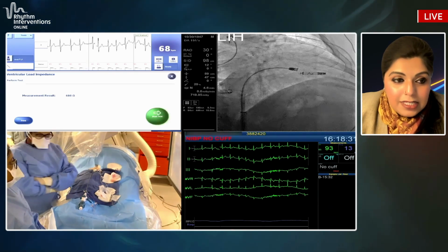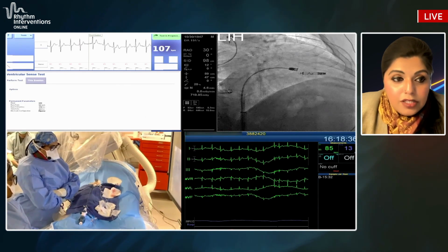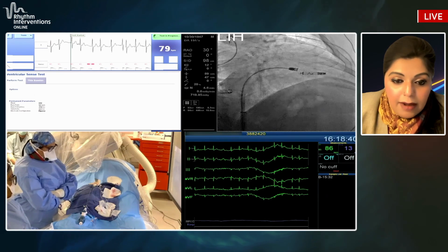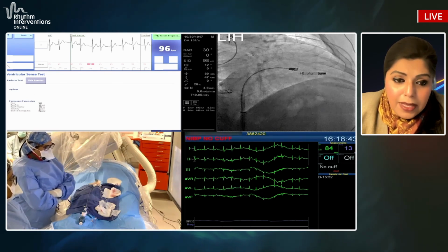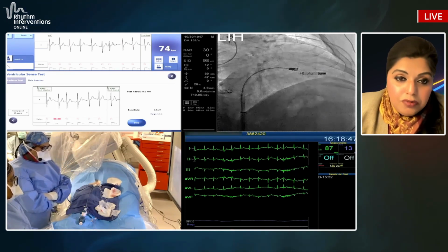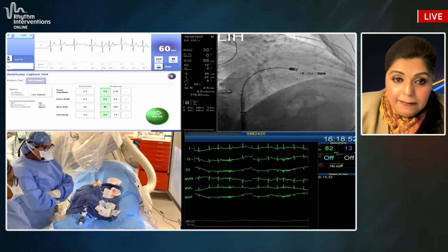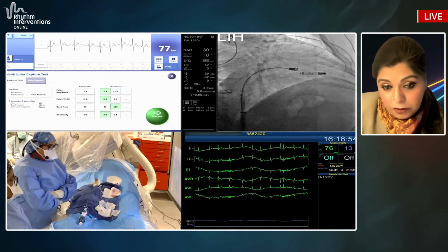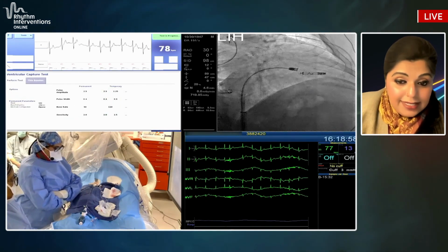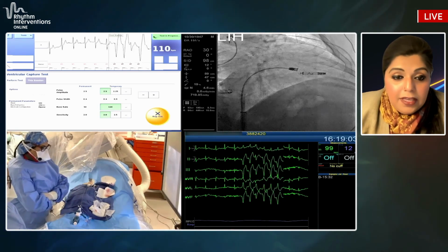So you can see the impedance has gone up. The current of injury was shown before, it was higher as well. So we'll look at the thresholds, we'll look at the sensing, again, do the entire mapping again. If you are seeing a lot of ectopy, sometimes just in the direction that it's sitting, you might have ectopy. You can actually adjust the docker based off of your deflection handle and make it more coaxial, so that while you're doing the retesting and all that stuff, you don't get a whole lot of issue with ectopy.